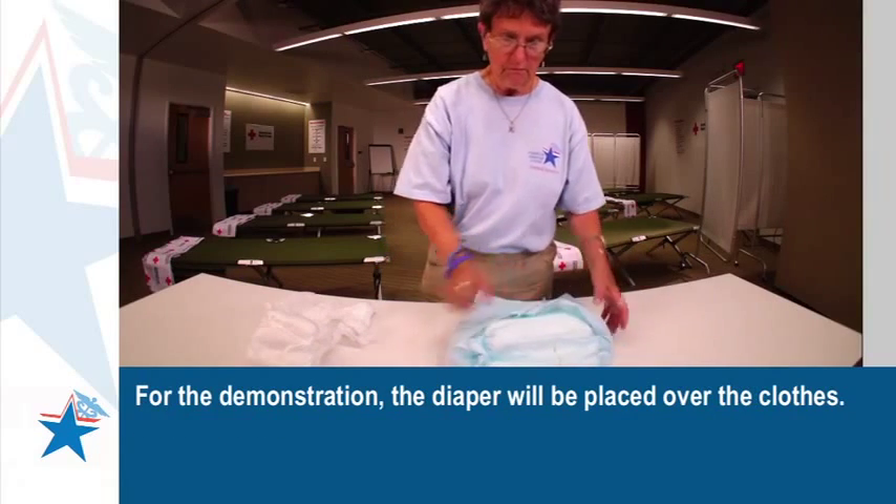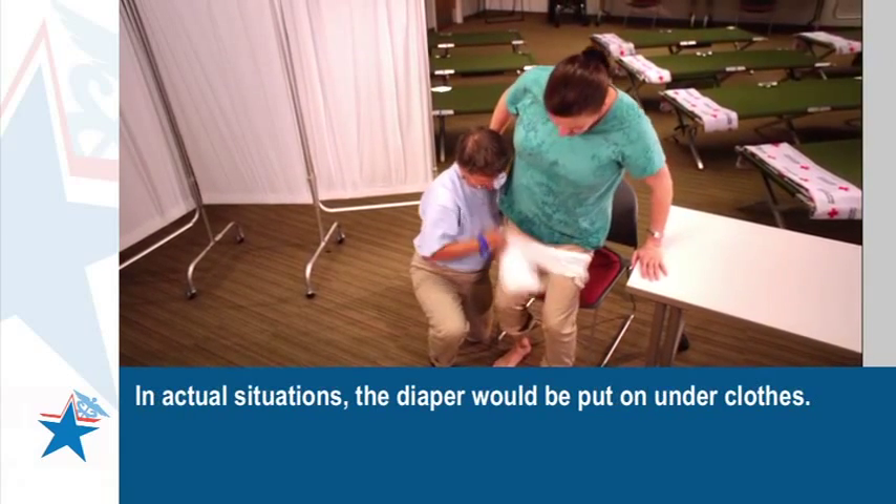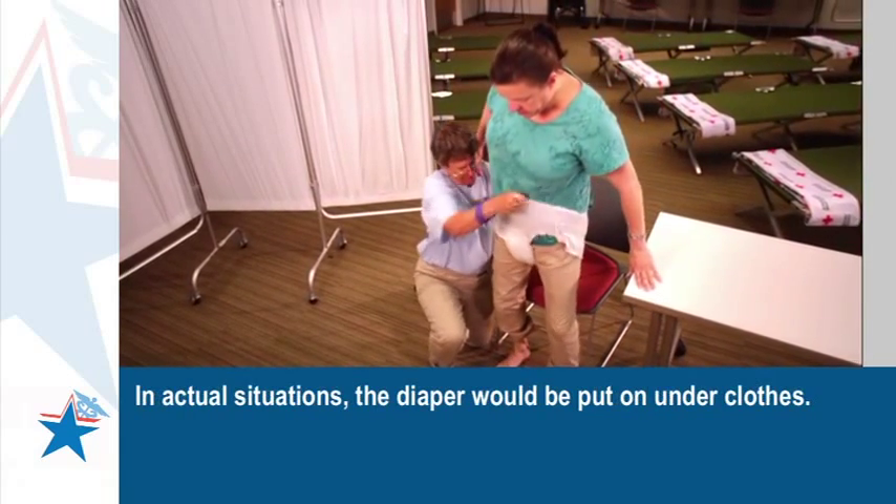For the demonstration, the diaper will be placed over the clothes. In actual situations, the diaper would be put on under clothes.